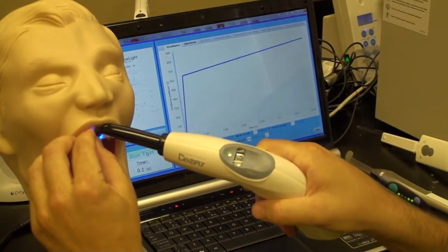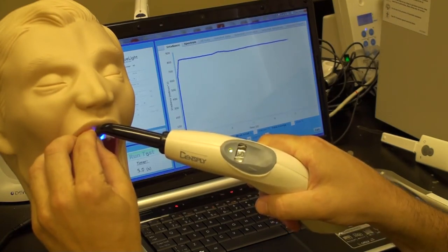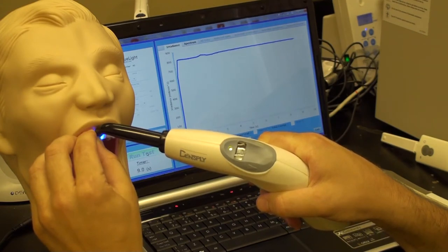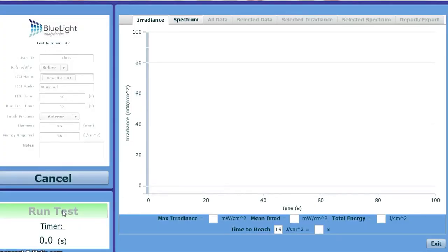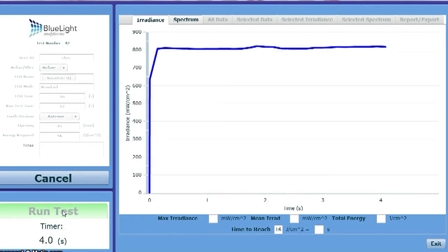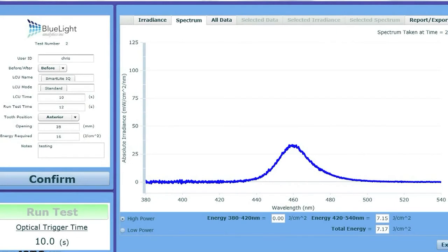Mark contains two sensors, one in the anterior region and one in the posterior region. These sensors measure the irradiance and the wavelength received by the restoration. The proprietary Mark software is easy to use and displays both the irradiance, total energy delivered, and also the spectral output from the curing light.